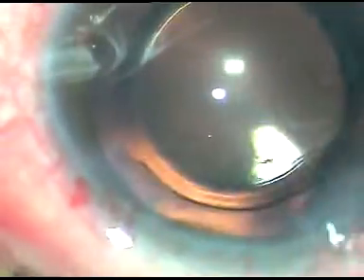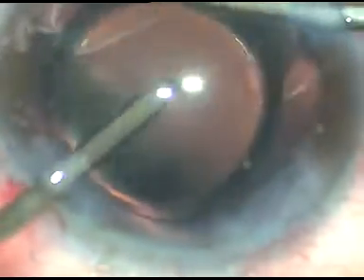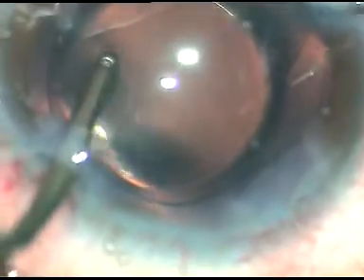Now I use bimanual IA to remove the viscoelastic substance thoroughly. I do not want any rise of intraocular pressure in the postoperative period.